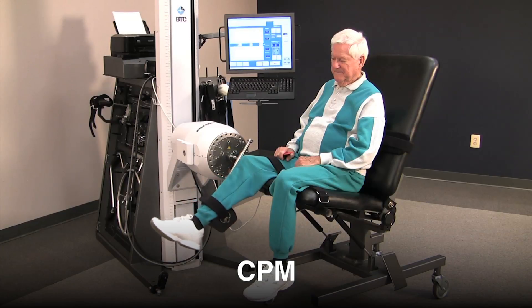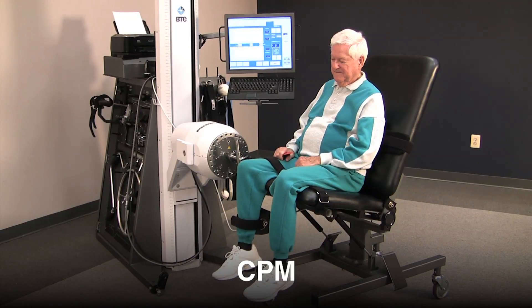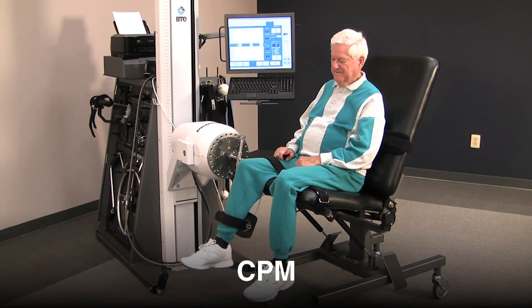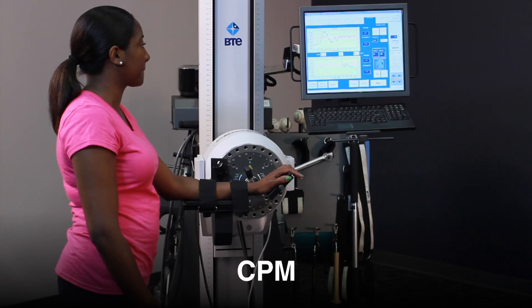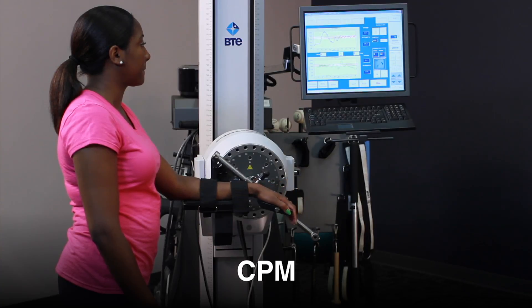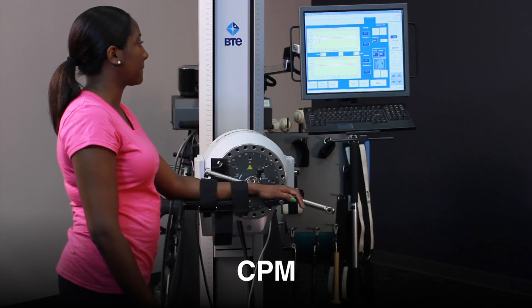CPM mode can be used for a variety of applications, including true passive motion to increase range of motion, active assist range of motion, and sub-maximum motor control training for neuromuscular re-education. In the early phases of rehab, when joint mobilization is needed, the Primus CPM mode comfortably guides the patient through the targeted range.